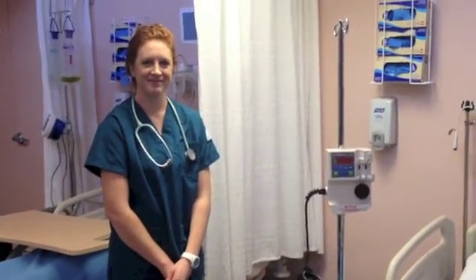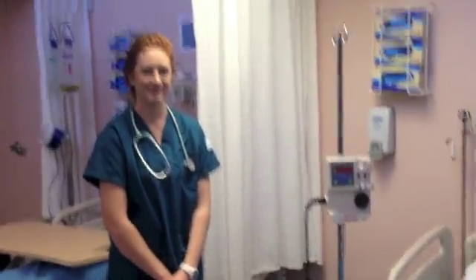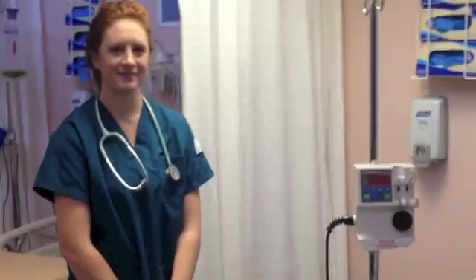Hello, the following is a demonstration of how to set up enteral feeding via a continuous drip or feeding pump. We will begin by first checking our MD orders, and next we will gather the appropriate supplies.